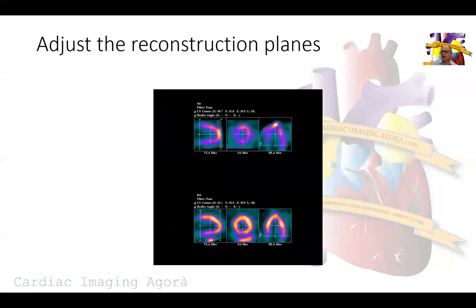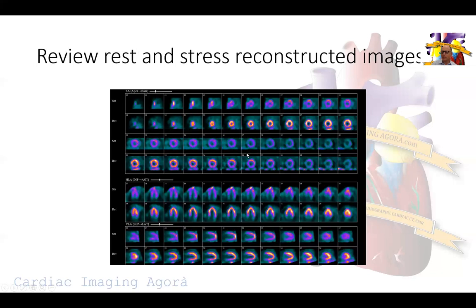These are the reconstructed images, so we start with rest on the bottom and stress images on top. We align the borders of the heart, try to eliminate as much extra-cardiac activity as we can, center this on the bullseyes, and then we process.